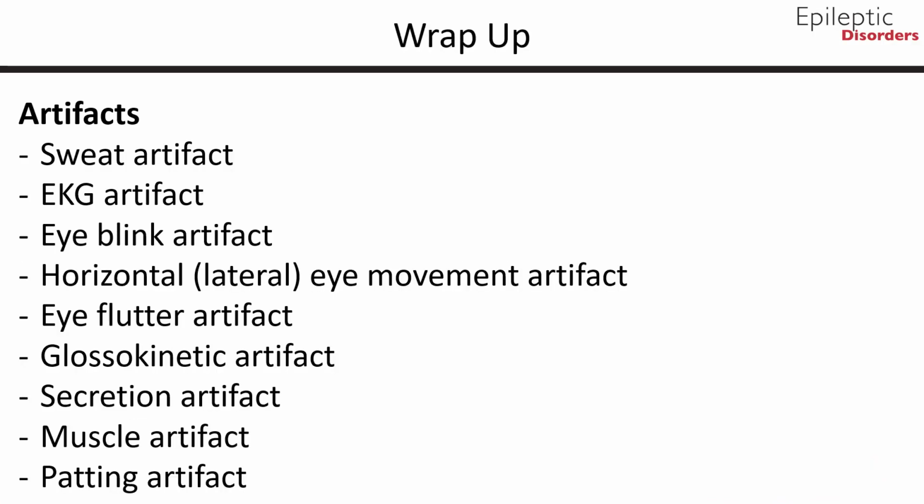To wrap up, in this module we have covered the most common EEG artifacts that you are most likely to encounter on your daily EEG reads.